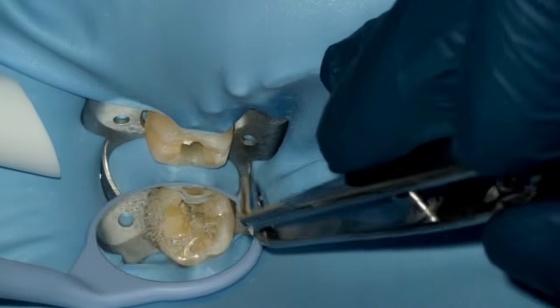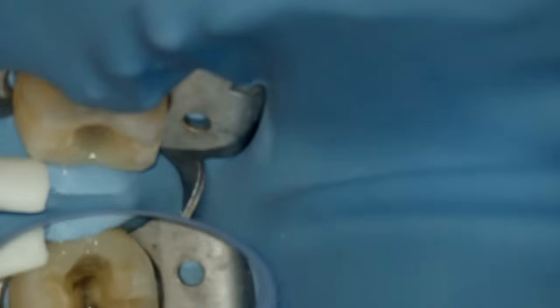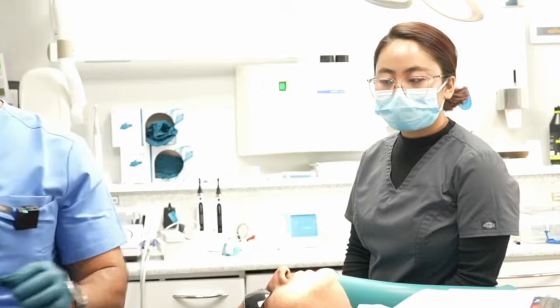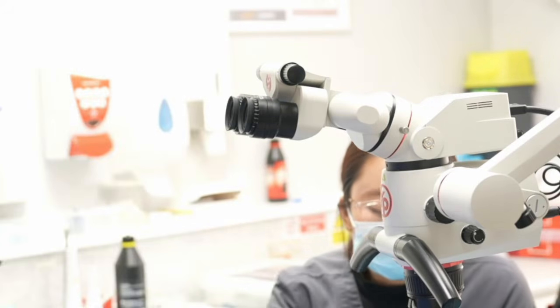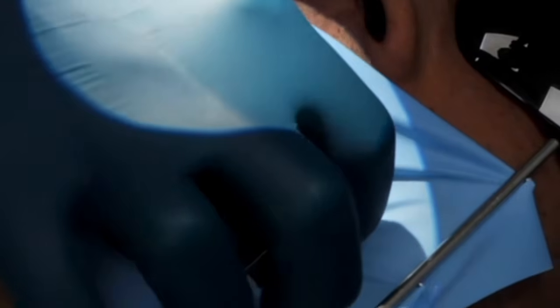If we don't destroy the floor of the pulp chamber, it can guide us to the orifices. A good paper to read is Krasner and Rankow, 2004. That will give you further information on the rules of orifice location and help you be more predictable in locating canals. However, when it came to working length determination, as you can see, those canals were really calcified, especially the MB, and we weren't able to achieve patency straight away. It took a little bit of time.